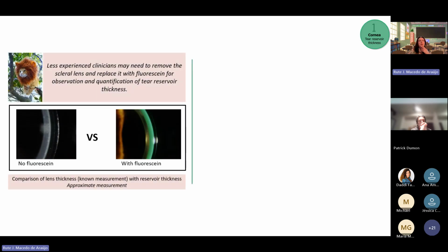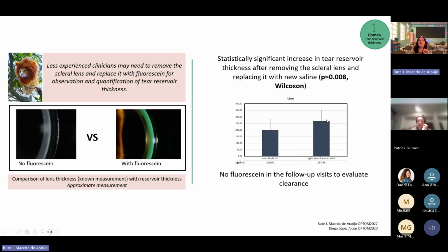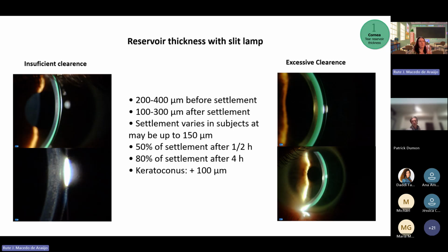Also, because doing the measurements without fluorescein will be more difficult, many less experienced practitioners, on the follow-up evaluations, remove the scleral lens and reinsert it with fluorescein. But I will tell you, this is not a good thing to do because it will increase the sagittal clearance after we remove and reinsert the lens. So, about the reservoir thickness: ensure that there is no touch at any part of the cornea.